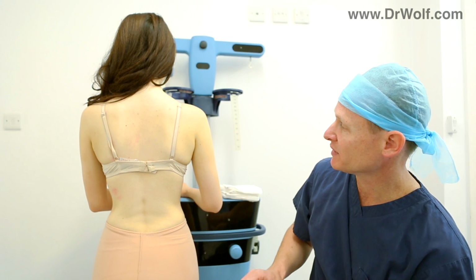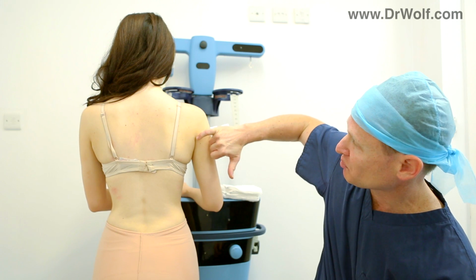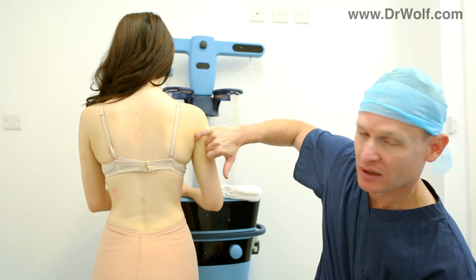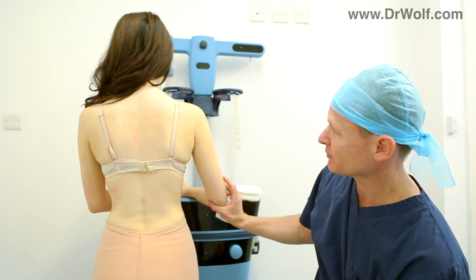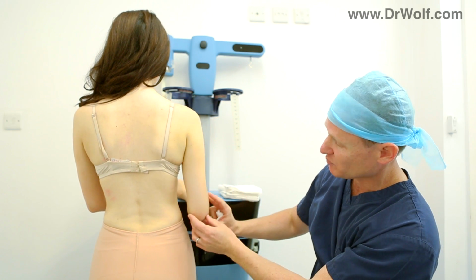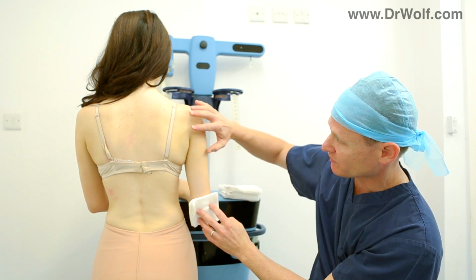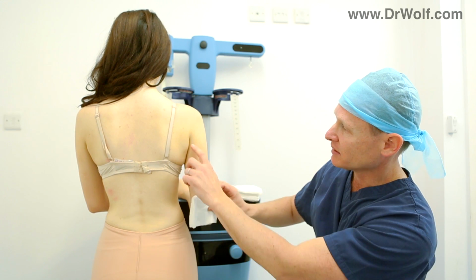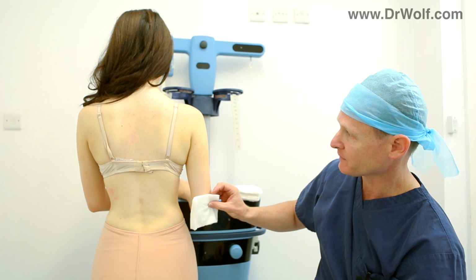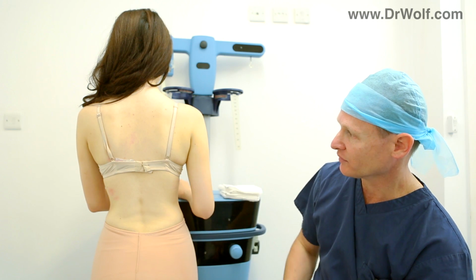I'm going to show you where the access points are for the treatment of the arms and the posterior axillary fold. I tend to place 1 just into this crease. So when the arm is in this flat position, the access point is not noticed at all. The only time you'll see it is when you raise your arm and you'll see the access point in this position. The other access point is in this part of the elbow, and this is where the majority of the leakage will take place because of gravitational effects. So the leakage that occurs here is very negligible. The majority of the leakage will take place from here. The compression garment involves the whole arm, and obviously leakage will occur from both sides.